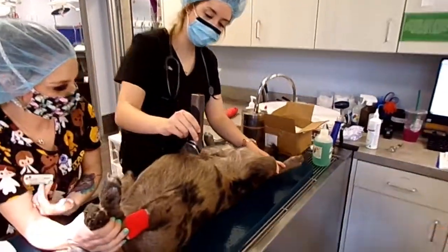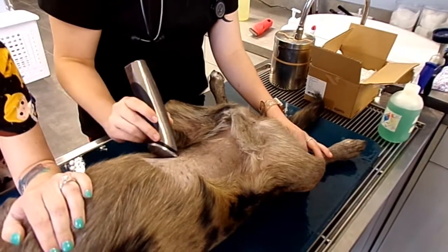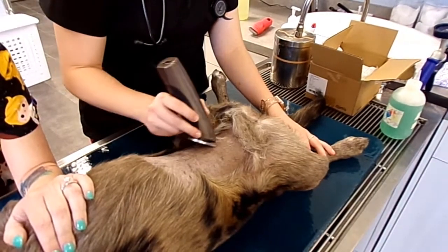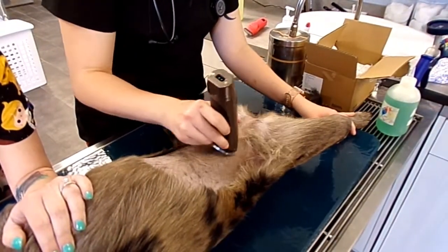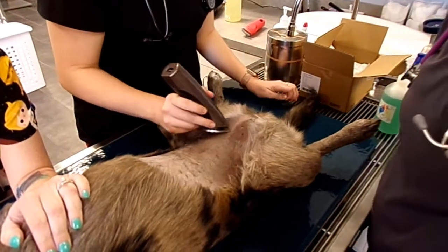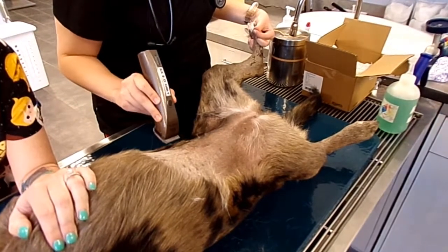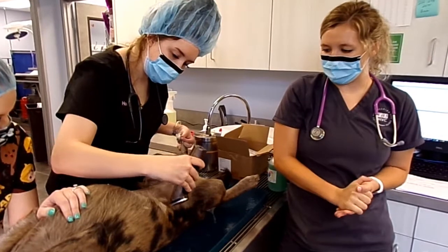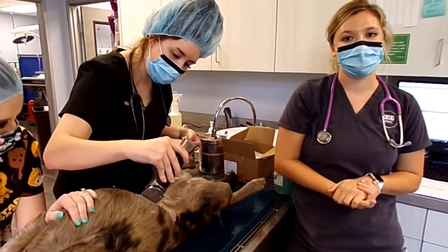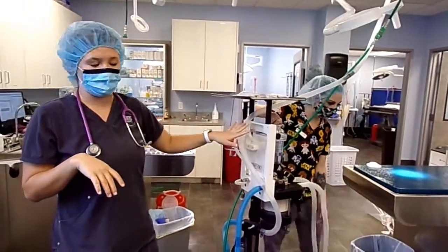Now Holly's going to start prepping the surgical area. For a spay, you want to start shaving from the bottom of the rib cage and all the way down. Here at Hillside, it's pretty much up to the nurses to induce our patients and get them on the OR table. We play a big role — we do everything from start until the surgeon begins making their cuts. Now that we've done our dirty scrub and prepped the area, we're going to come into the OR.